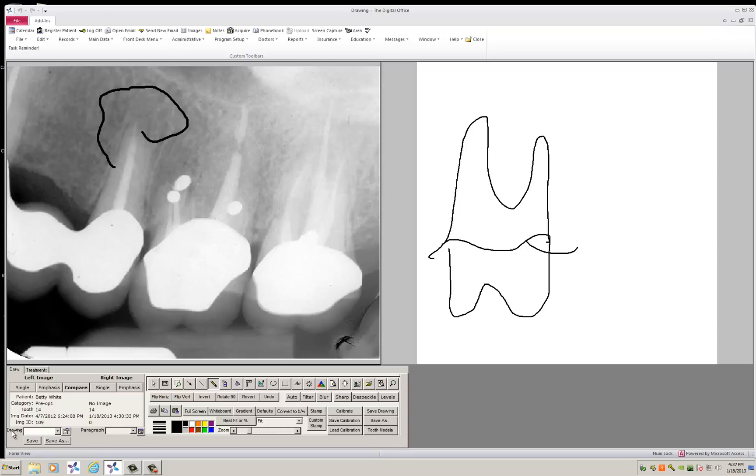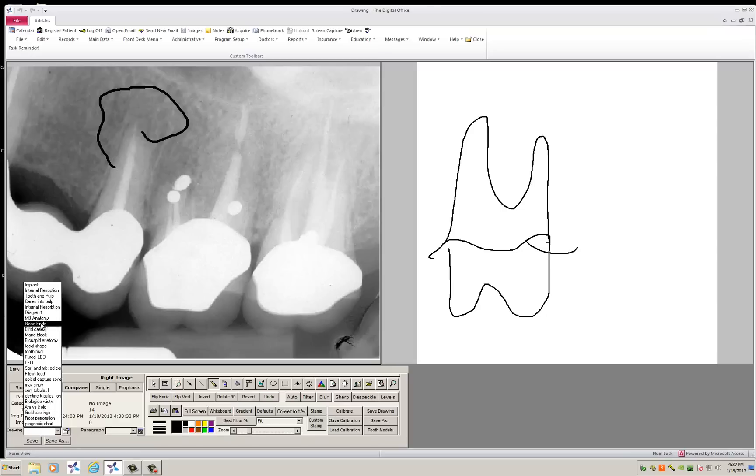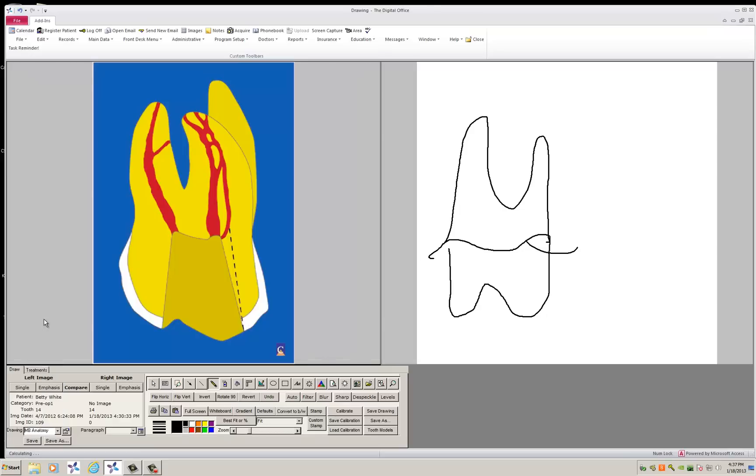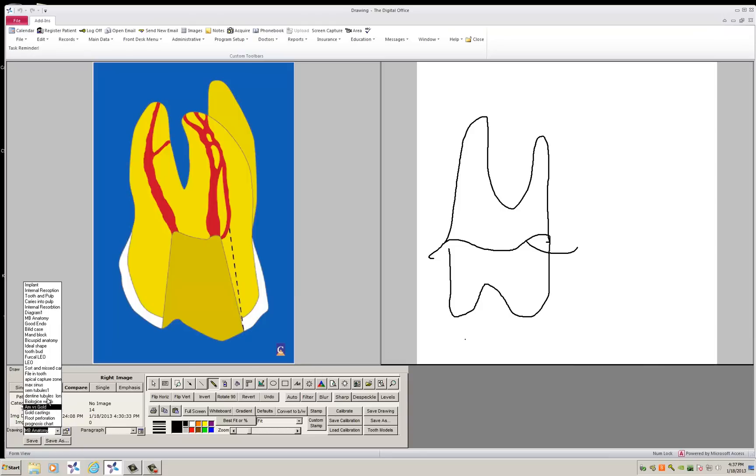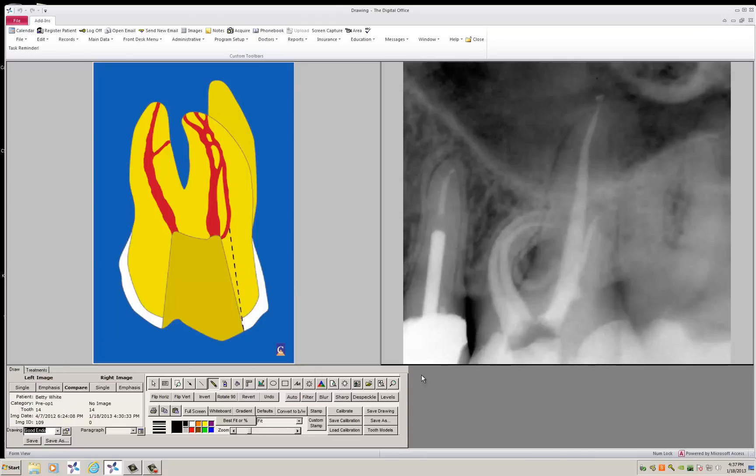And those are located right here where your predefined drawings are. TDO comes with a series of these which you can load. This is a very powerful way to communicate with the patient. When you click over on the right, you can load another diagram from your predefined drawing.